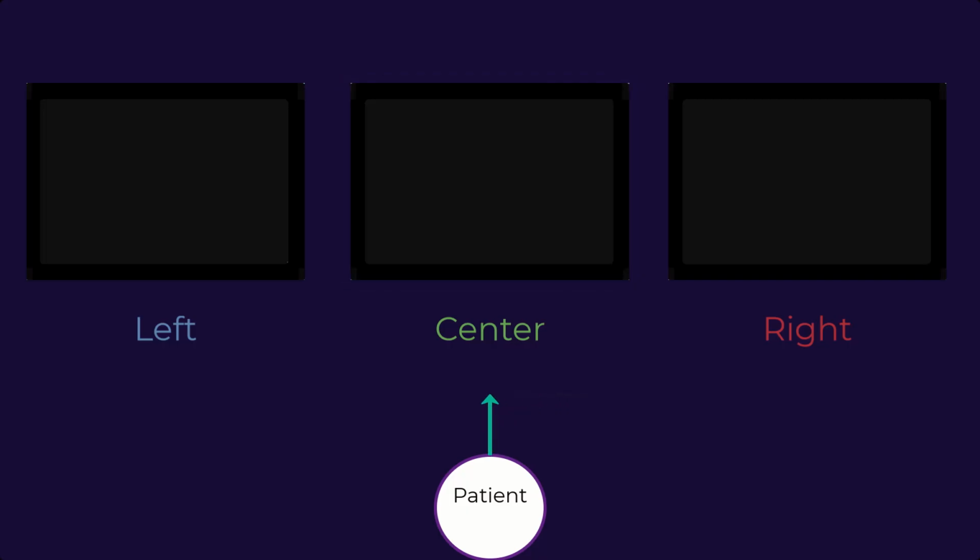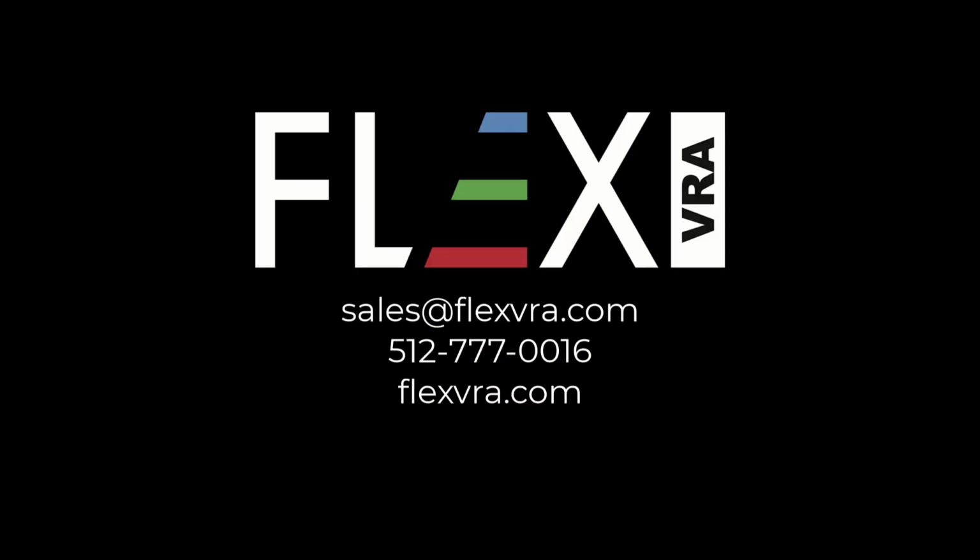So again, there's a lot of different options you can have with house rules to make your center be differentiated. But we think it's going to be a really valuable tool, and we're excited to offer it in 2026.